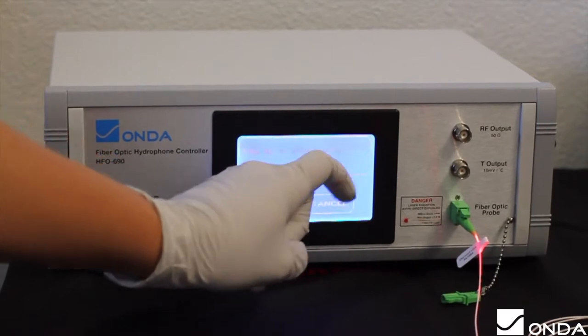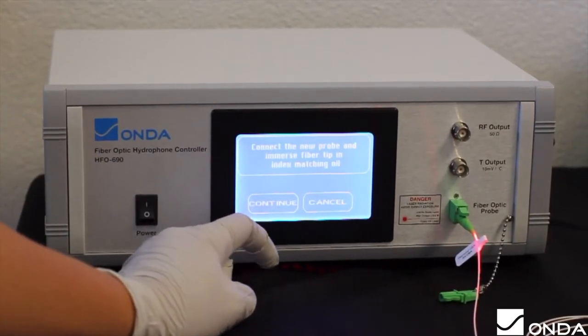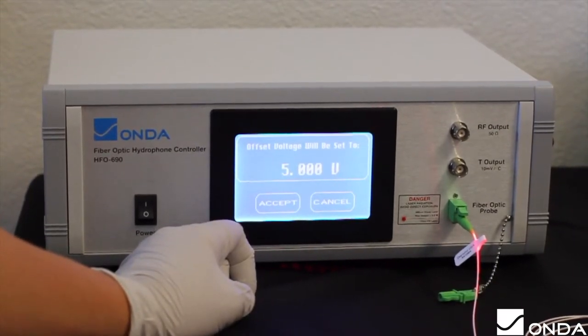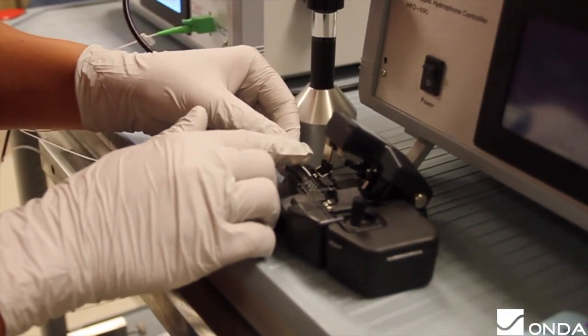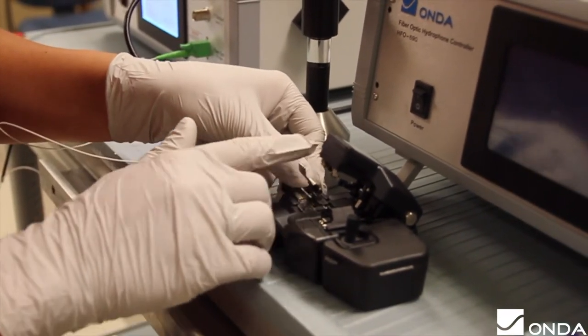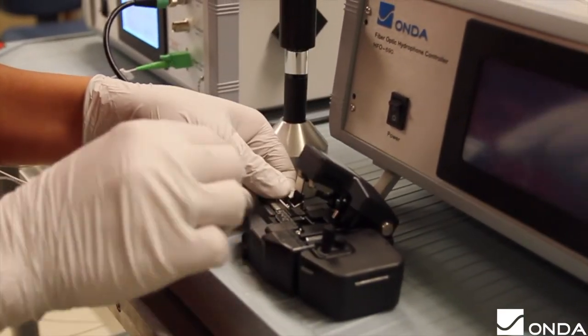If the measured offset voltage is higher than 0.5, press cancel and turn off the laser in the main menu. Restrip, clean, and recleave the fiber tip before trying again. Always make sure to clean and cleave the fiber tip again between the DC offset calibration and sensitivity calibration.